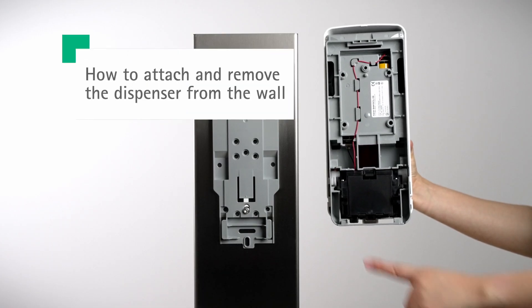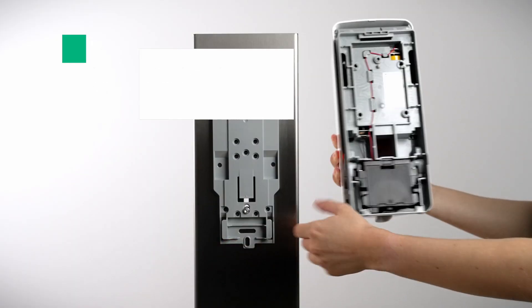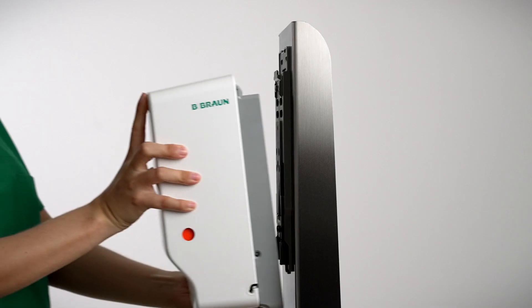To attach the wall dispenser to the backplate, the two knobs must be snapped into the slots on the lower side of the backplate. Push the wall dispenser up and against the wall. The last step is to move the dispenser down.